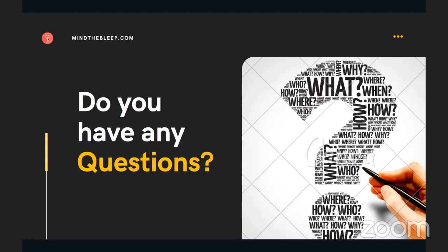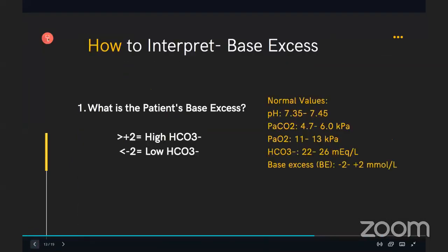So there's been one question that's come through from Carolina asking if you could just go over calculating what PaO2 you'd expect when they're on some sort of oxygen therapy, just figuring out how much PaO2 you'd expect to be on the blood gas. Yep, so I'll just go back to that slide.